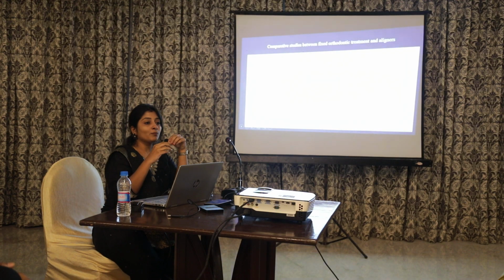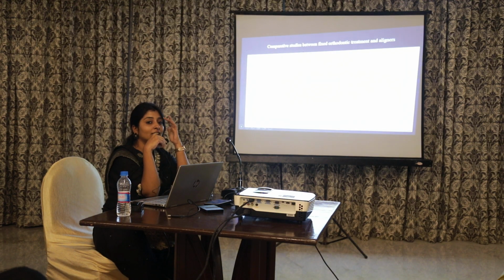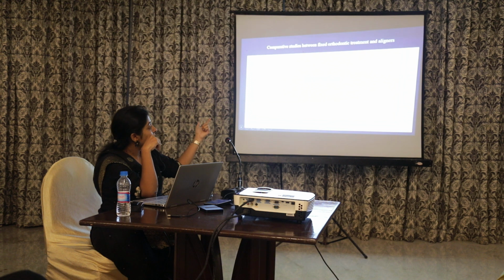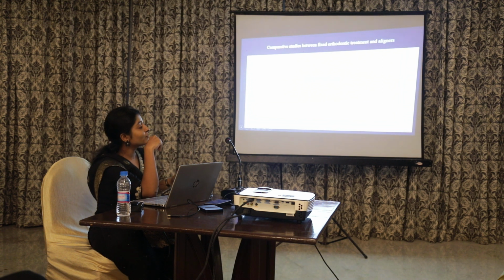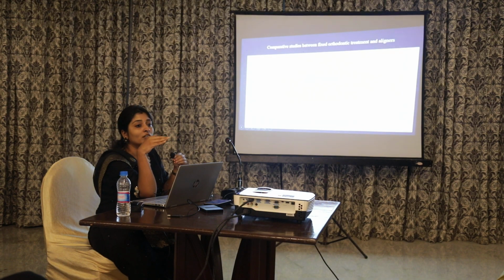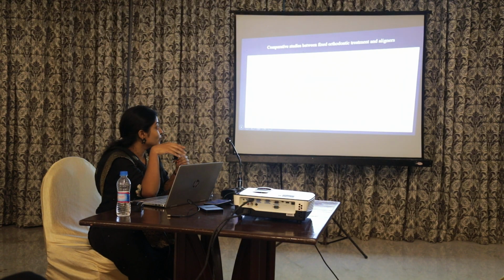So there are other comparative studies that have been done in relation to the fixed conventional appliance and the Invisalign in terms of speech, eating restrictions and mucosal ulcerations. From the study they have concluded that whenever we are treating patients with these aligners, there is a speech difficulty in the initial stages, but the speech definitely gets better once they get accustomed to the aligners.